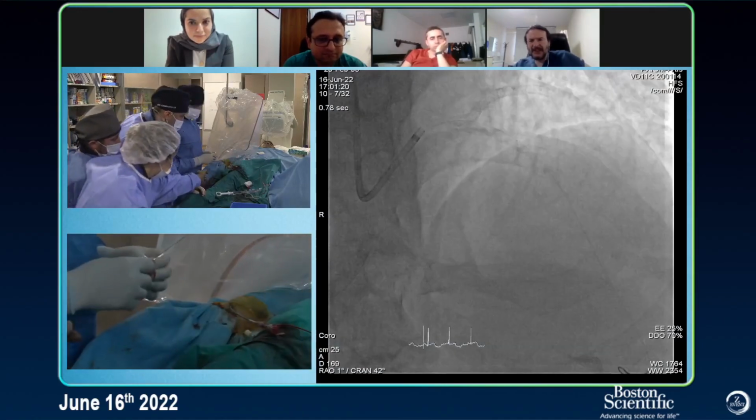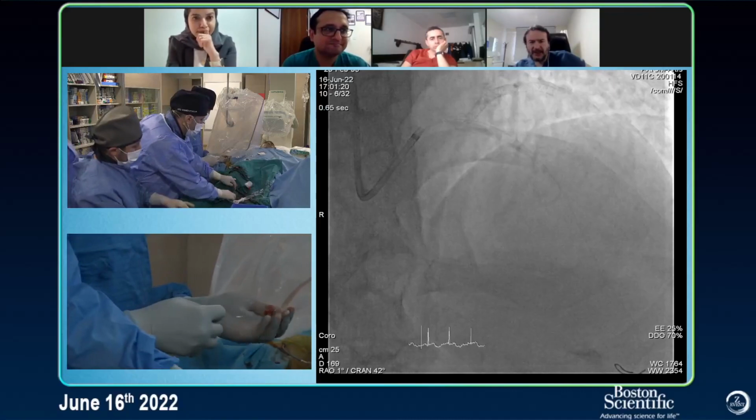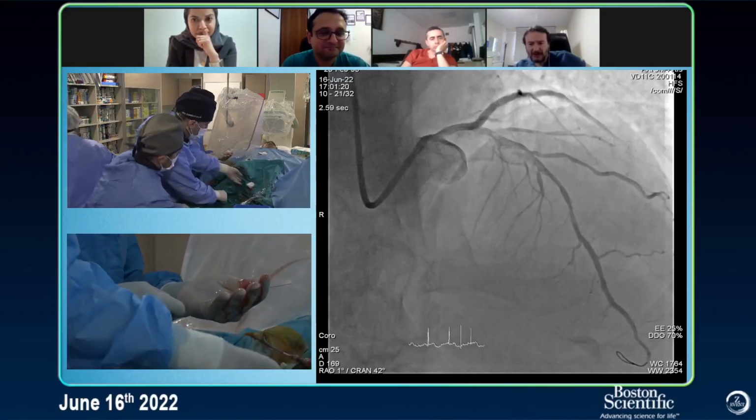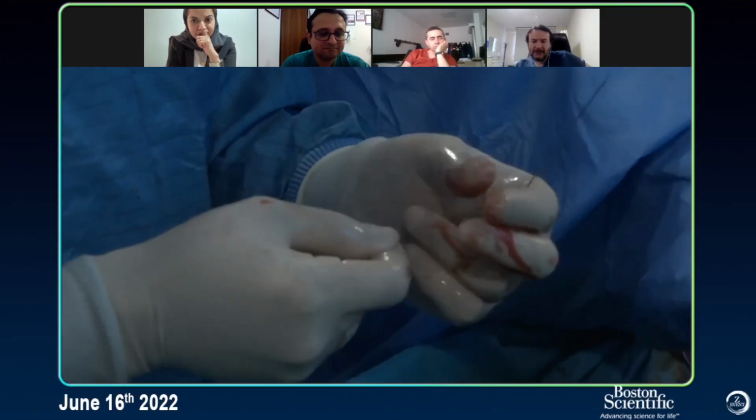Okay, how much? It's not that bad. We did it very quickly. It's not that bad in this position. How much is it, and then how much? It was 300. All right.